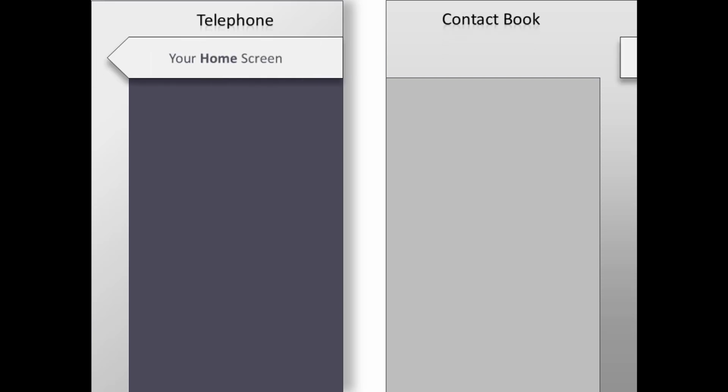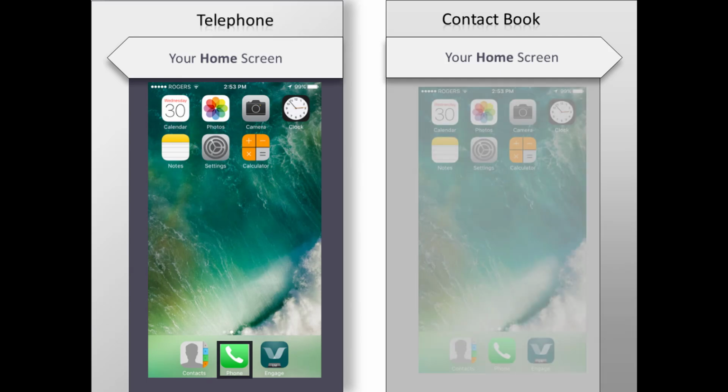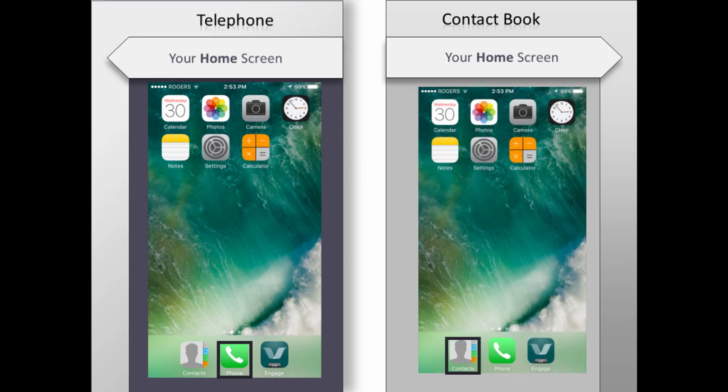You may use your phone to make internal and external calls. Click on the phone icon in the bottom of the home screen. There is also a contact book located beside the phone icon that will hold many of the unit's frequently used numbers.